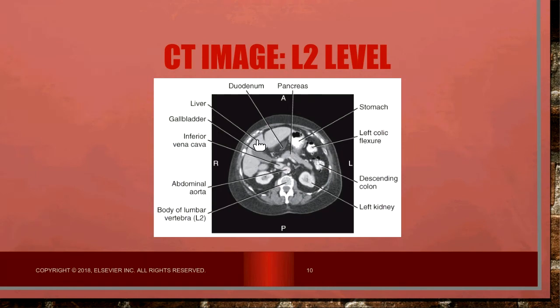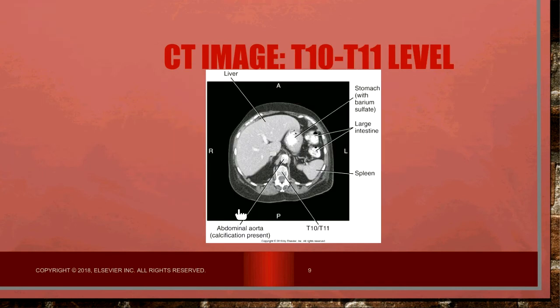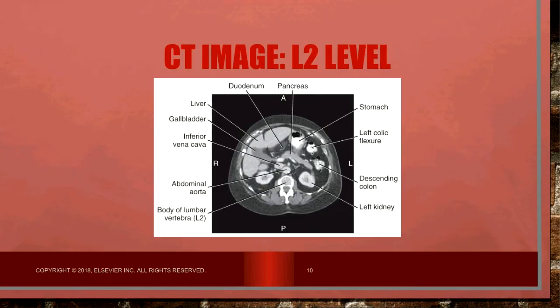Are you in the bulk of the liver, where it's still taking up a good chunk of the whole right side, which means you're not through the whole liver yet? When you get to the lumbar spine, you can tell that you've come down through the bottom of it. Now you're on the underside of it. That's why you can visualize the gallbladder. So just something to start doing, making note of the anatomy, looking at how it's visualized and how it plays out, is a good thing to do.